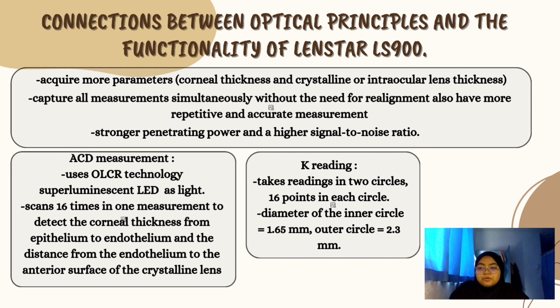Okay, so next we move to the connection between the optical principle and the functionality of the Lenstar. As we know, the Lenstar can acquire more parameters such as cornea thickness and the intraocular lens thickness, as it can capture all measurements simultaneously without the need for realignment.